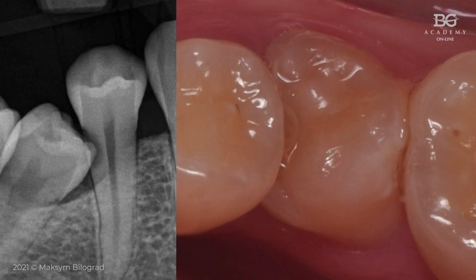From the initial slide you can see a deep distal defect and the necessity to do root canal treatment. Imagine if you go for standard protocols of access formation, maybe you will end up with no tooth at the end. The situation was pretty difficult, not just because of the deep decay, but also because the adjacent tooth, the second premolar, was not erupted completely, and we faced difficulty providing proper rubber dam isolation for endodontic treatment. So let's go.